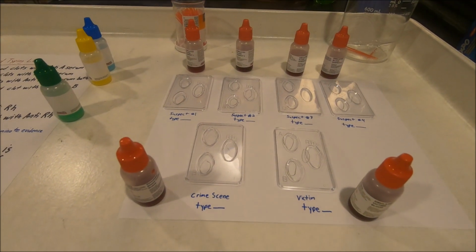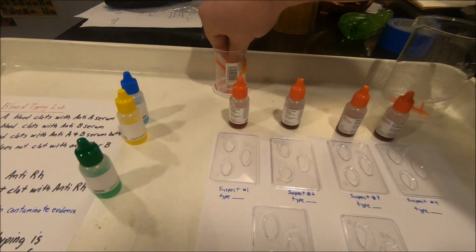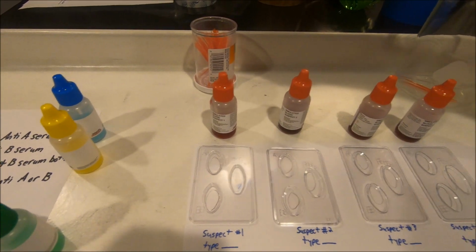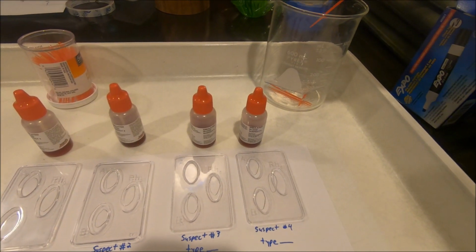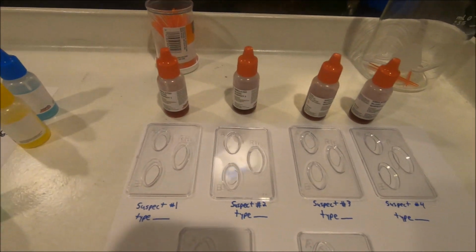Now, one of the keys is to avoid contamination. So as we're starting out, we only want to use our stir sticks once before we get rid of them. We'll put them into the trash can afterwards so we avoid contamination, and we make sure we keep each suspect separate.